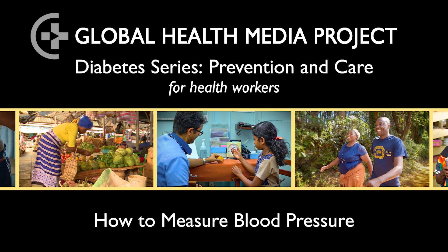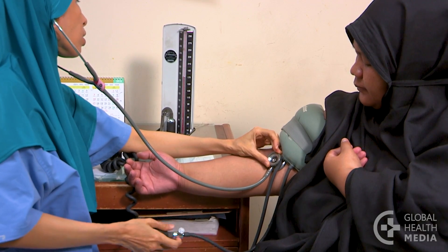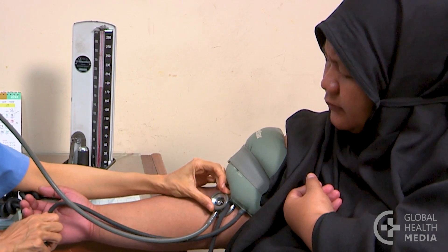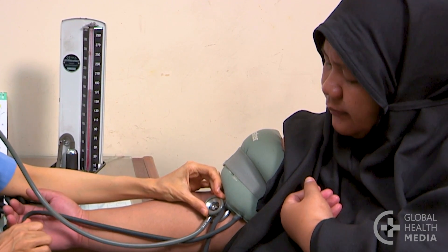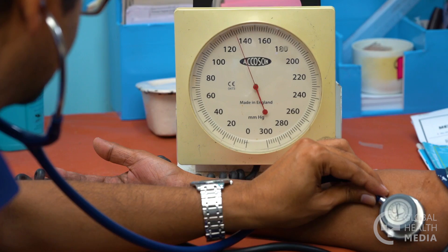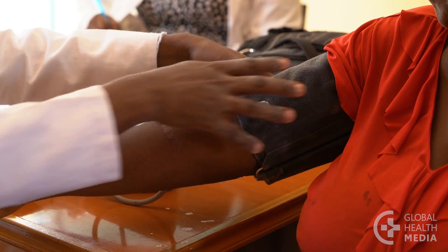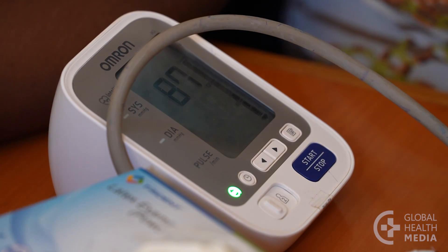How to measure blood pressure. Measuring blood pressure is a basic clinical skill. Sometimes, though, steps are missed, leading to inaccurate readings. Here's how to measure blood pressure correctly using a manual device. The same procedure is followed with a digital device, but without a stethoscope.